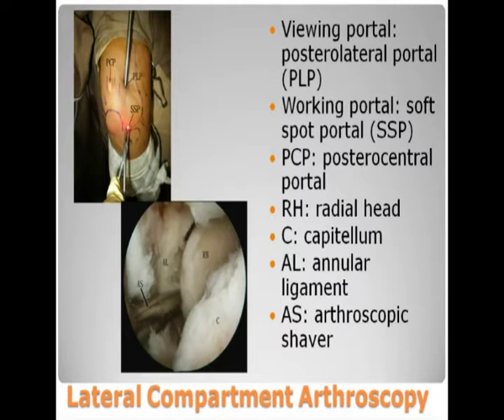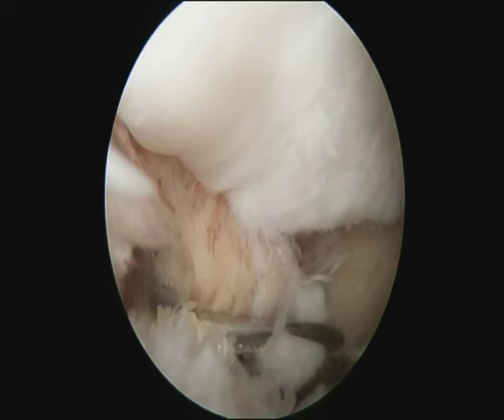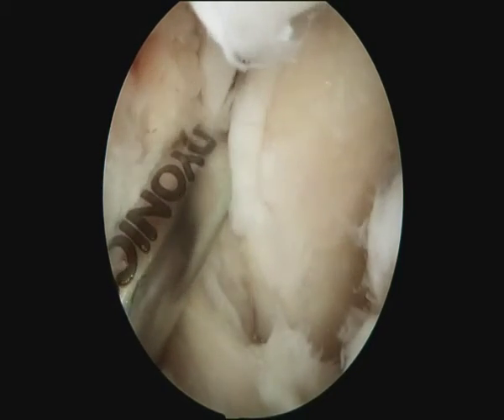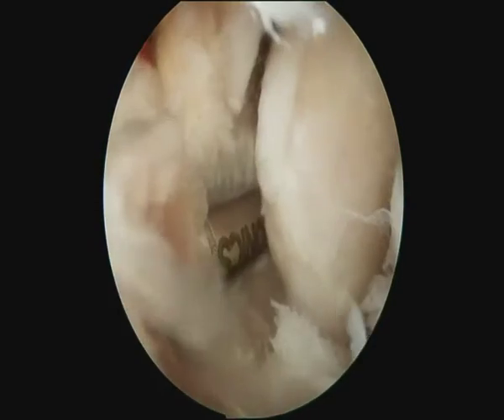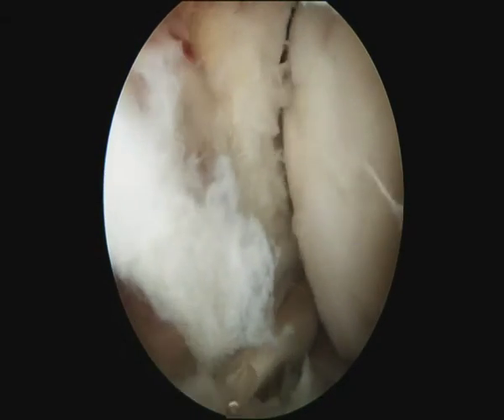Secondly, lateral compartment arthroscopy is performed through the posterior lateral and soft spot portals. Again, loose bodies are removed and synovectomy is performed. The synovial recess deep to the annular ligament should be divided in order to achieve a complete synovectomy.